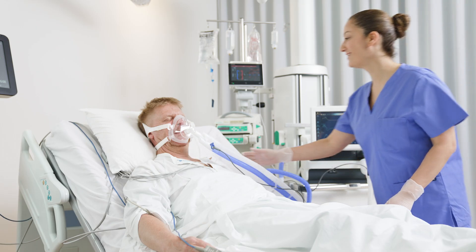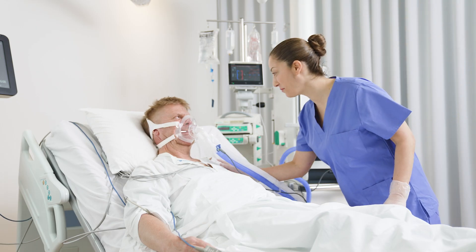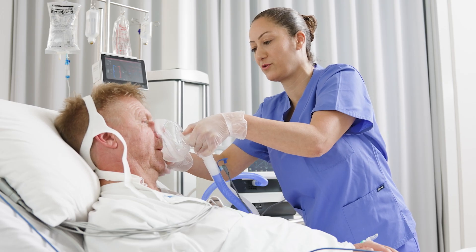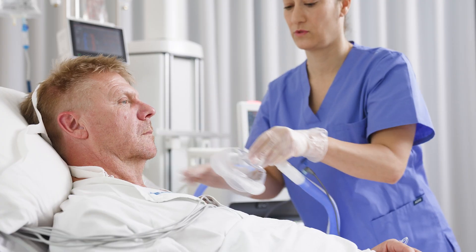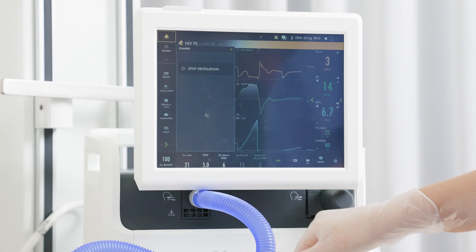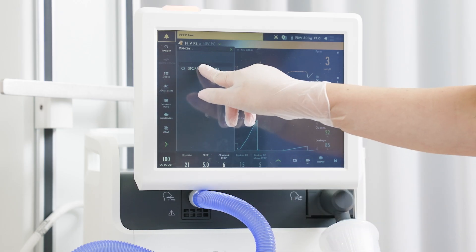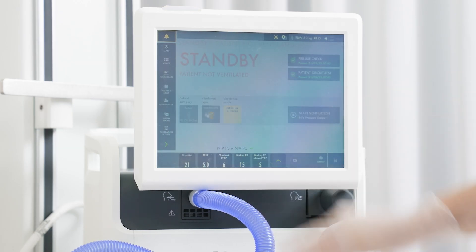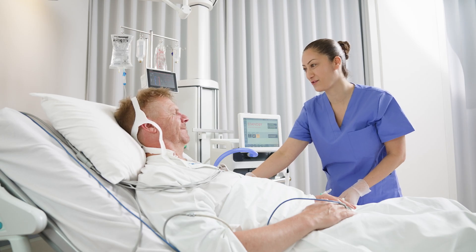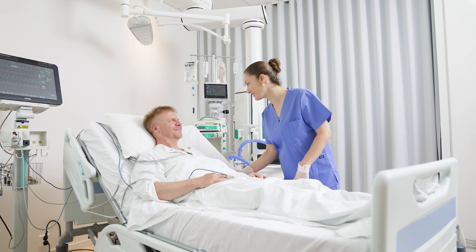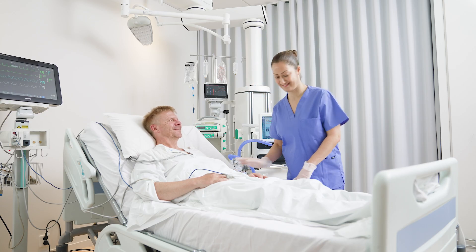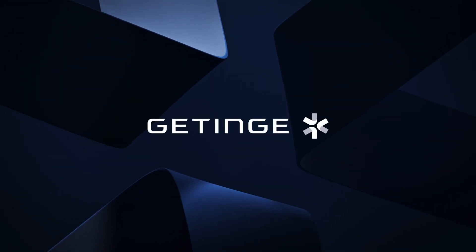To stop non-invasive ventilation, remove the patient interface. Tap the standby tile in the upper left-hand corner on the screen, then tap and hold Stop Ventilation to go into standby. For more training material, go to our website at gettinga.com.